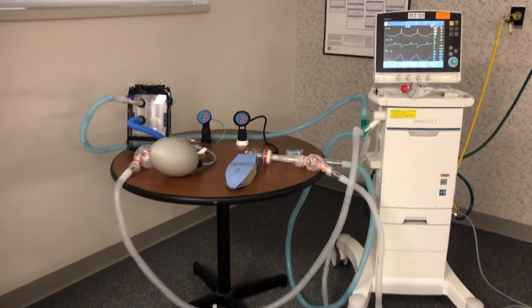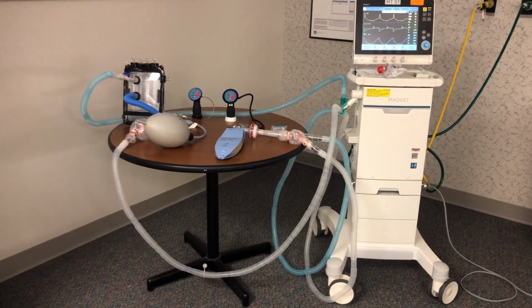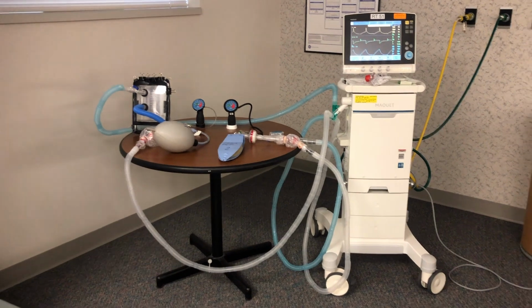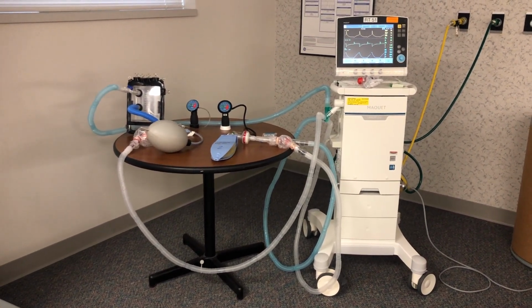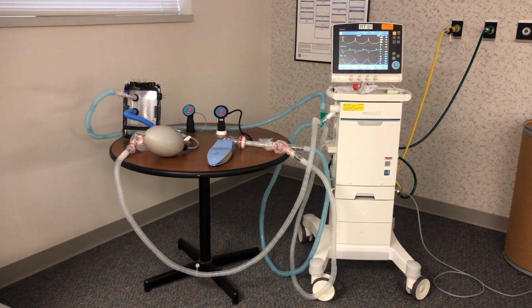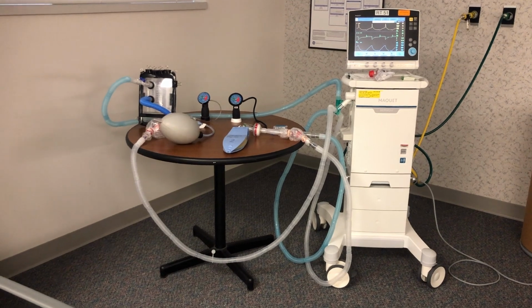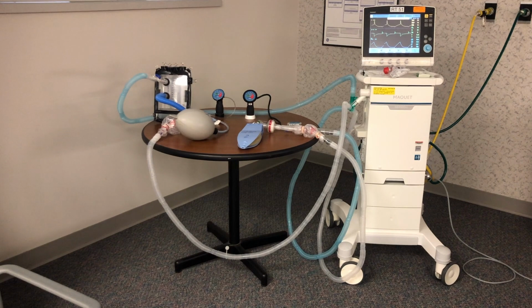Please feel free to comment and forward this video to healthcare authorities and healthcare people who are in dire need of ventilators. I cannot officially, or the organizations cannot officially at this time, endorse this video because it has not been tested on humans, but currently if you are in a situation where a person is not going to make it because of the lack of ventilator, I don't think we have any other choice.